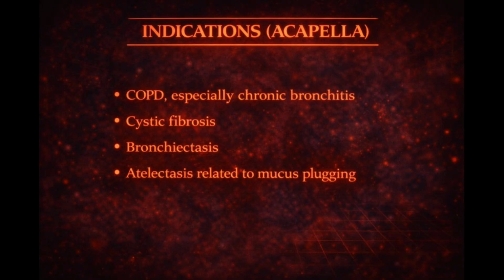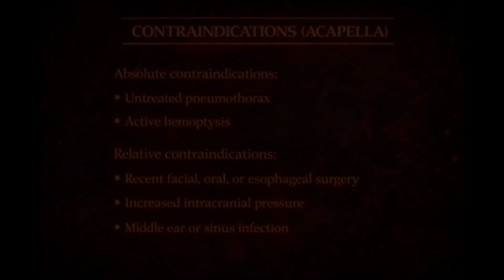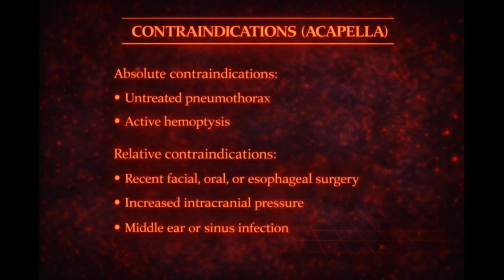The indications for the Acapella therapy include conditions associated with retained secretions, such as COPD, especially in patients that have chronic bronchitis, cystic fibrosis, bronchiectasis, and atelectasis related to mucus plugging. Ideal patients are those who are alert, cooperative, and able to follow instructions. The contraindications of the Acapella are absolute: untreated pneumothorax and active hemoptysis.